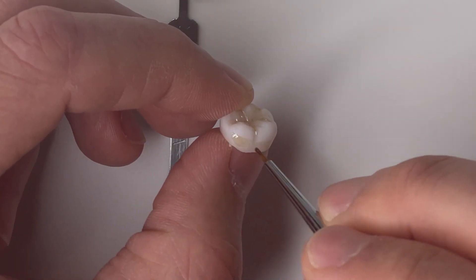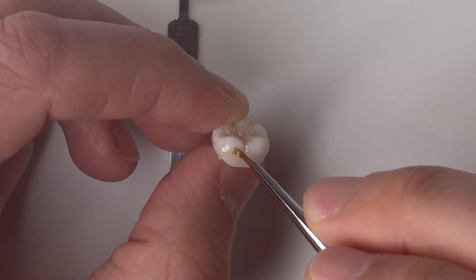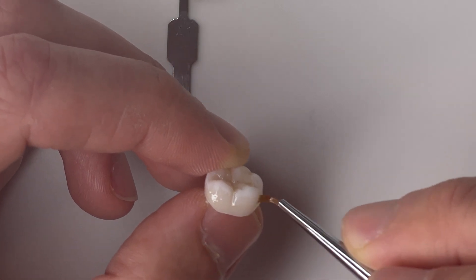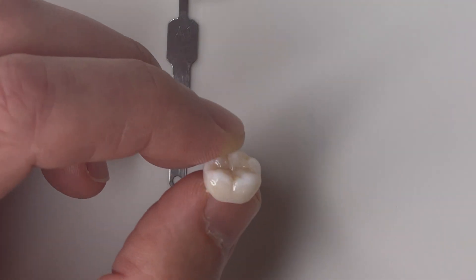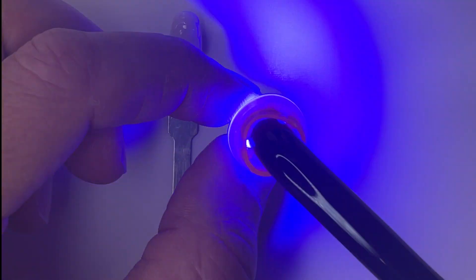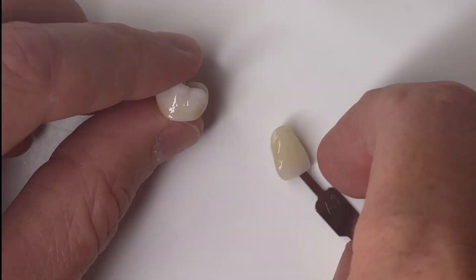Now I'm going to switch to the lingual and basically do the same thing I did on the buccal. The idea here is we have this A shade chroma and we're just stacking multiple layers in the areas where we want the most chroma, and maybe using just a single layer in areas where we want just a little bit — in this case on a molar that would be the cusp tips.